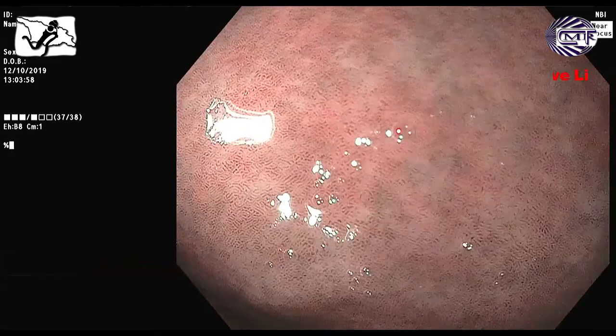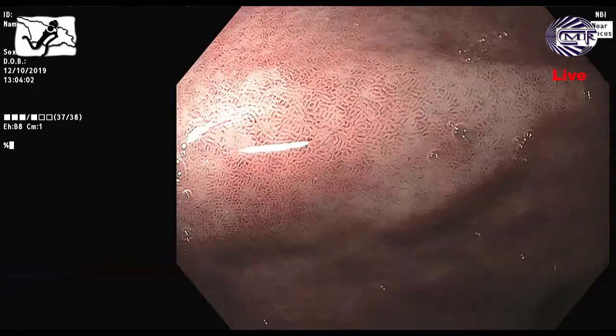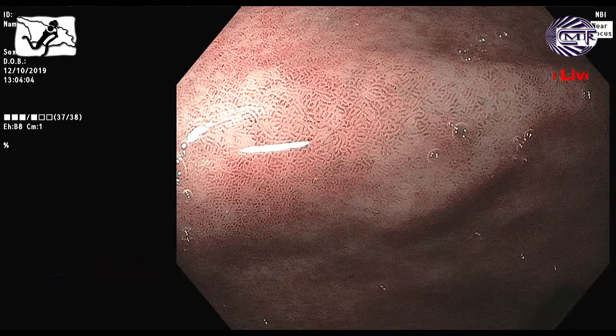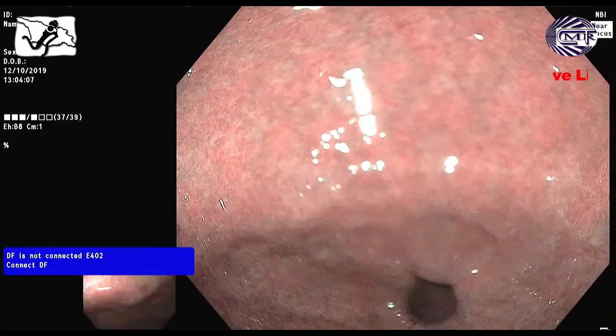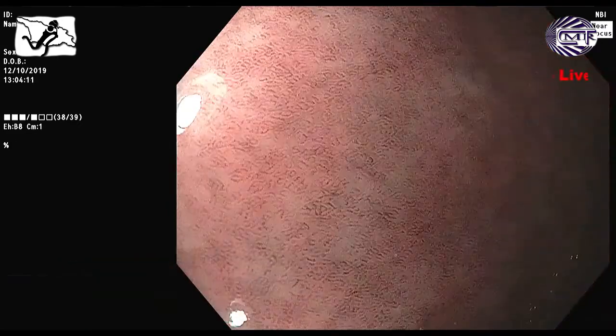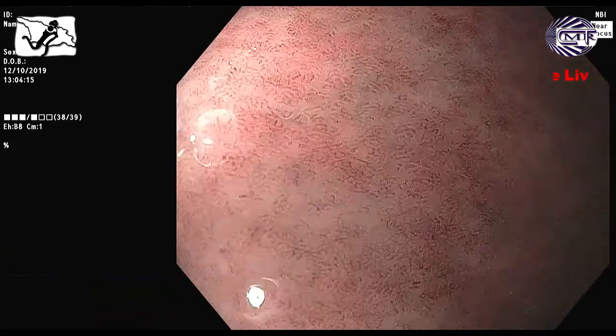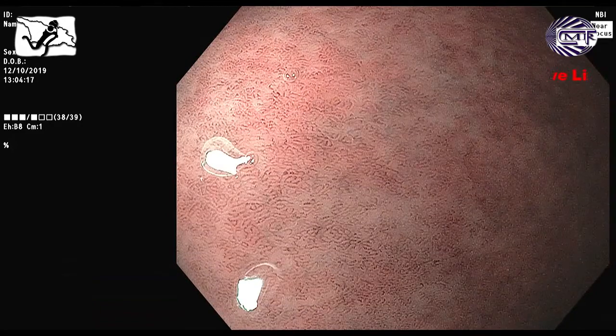Normally, not normal shape, but the usual common shape of antrum mucosa and body is totally different. This is not honeycomb, right? Look at this. This is intestinal metaplasia. Like the white one is intestinal metaplasia here, in the center.